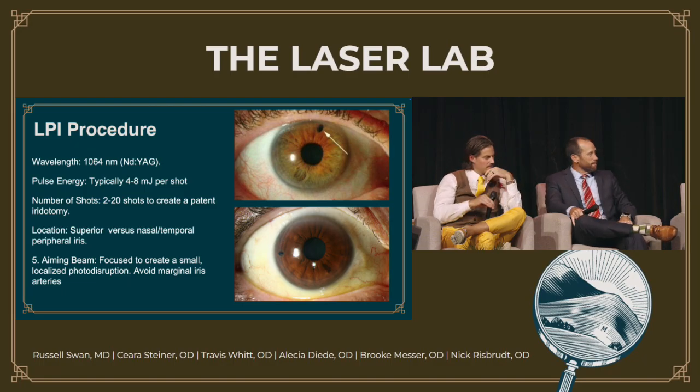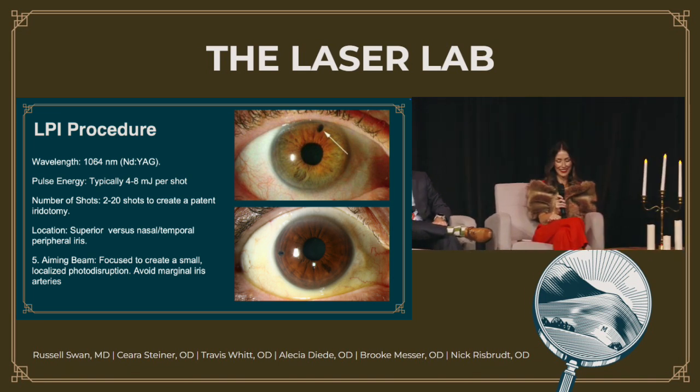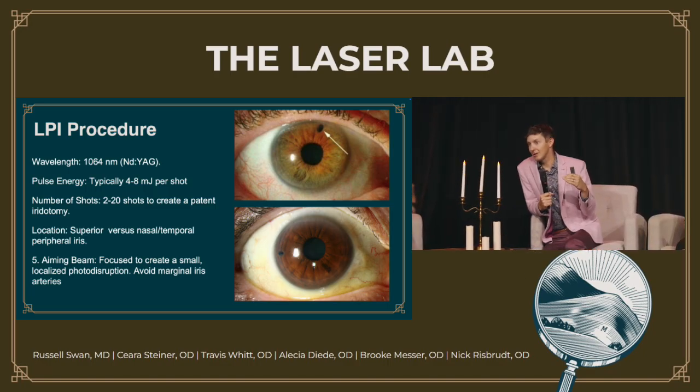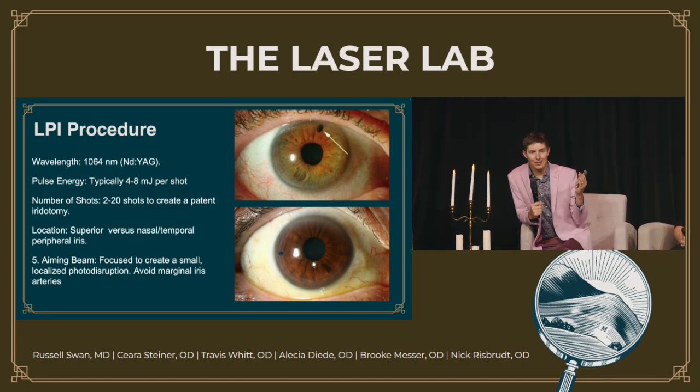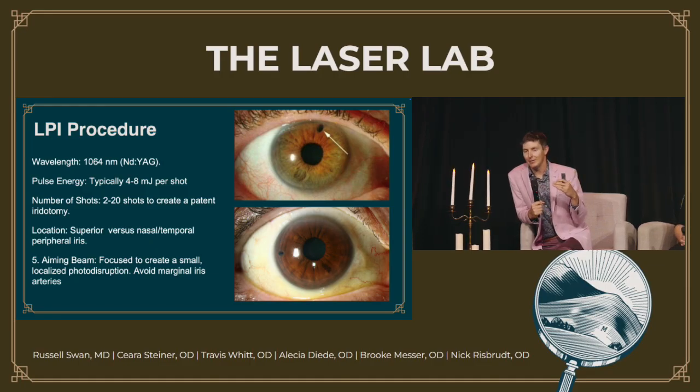Okay, sounds good. Interestingly, historically, the rule of thumb was always superior. Then there was data that came out that showed maybe the horizontal plane actually did cause less photopsias for patients. Most of the meta-analyses have shown that it's probably a similar rate of dysphotopsia. When we go to our glaucoma days, people get very esoteric about it and some have very strong opinions, but the data actually shows that whether it's superior, nasal, or temporal, there's probably not a huge difference. We very rarely do it inferior, except in one situation.